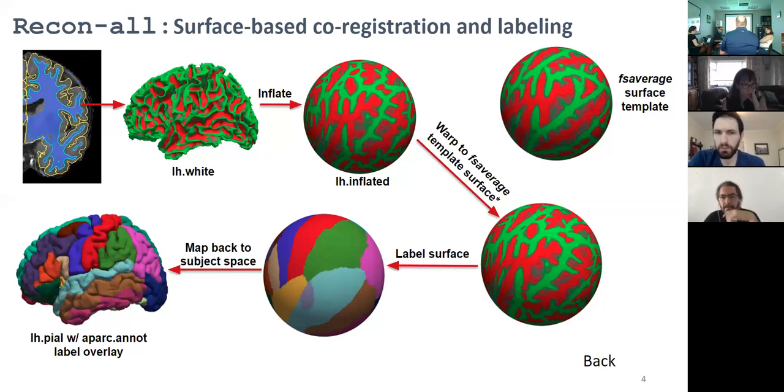And you saw that once you got into the low teens, it started to asymptote. We ended up using something like around 20 total for that. I was talking with the FreeSurfer people, and they said that's essentially what they saw too. So when you add in those others, it's possible that may capture some more of the variability in anatomy, and that maybe certain brains would help more. But it seemed like it didn't make that big a difference.